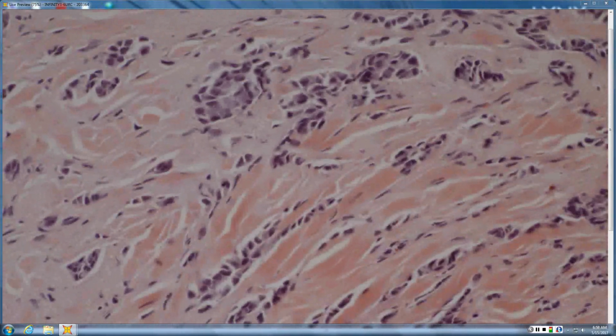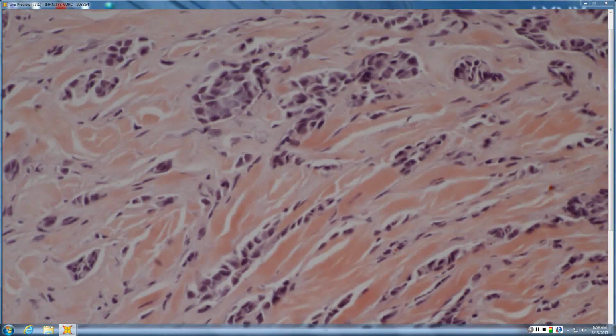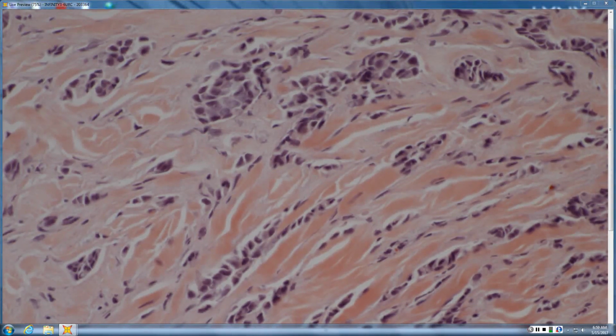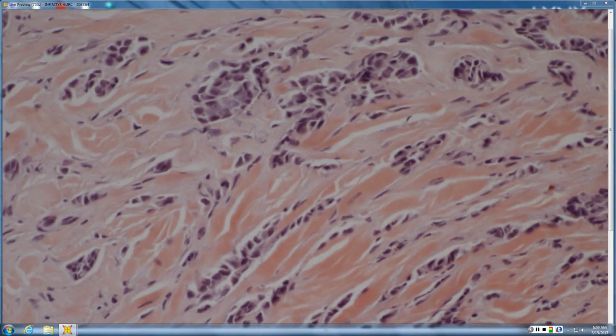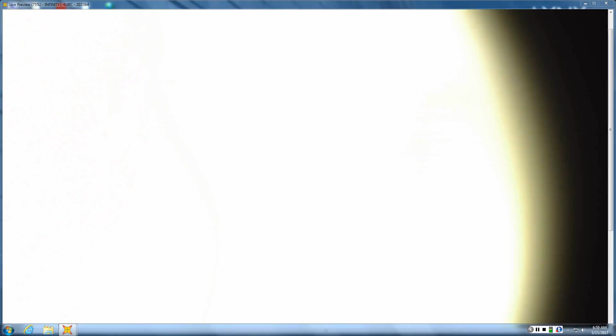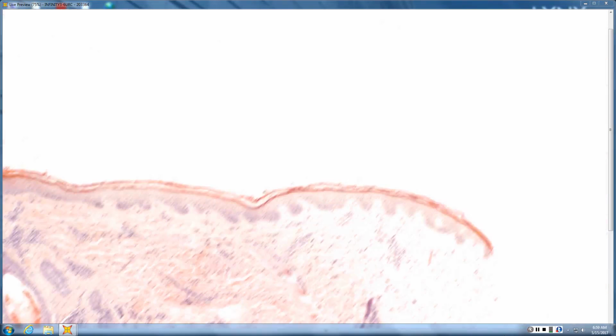And you can also use the boxcar term for some of these, and when you get the larger hyperchromatic ones that line up with that nuclear molding and all that, it's basically the same thing. So this one we throw a ton of stains on and then find out where it came from, which is most commonly breast, but can be different things. So that's that one.